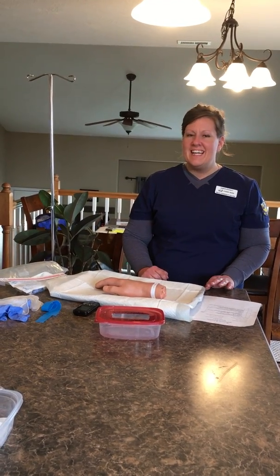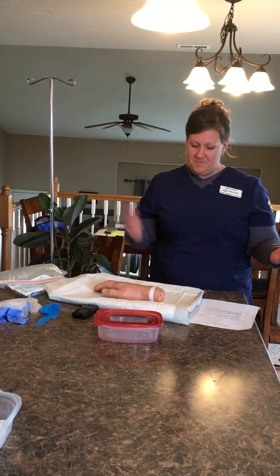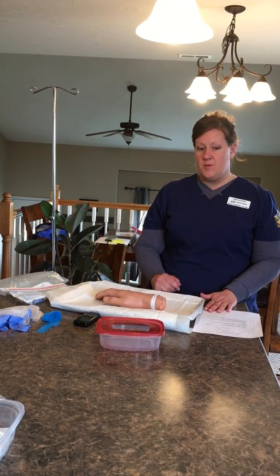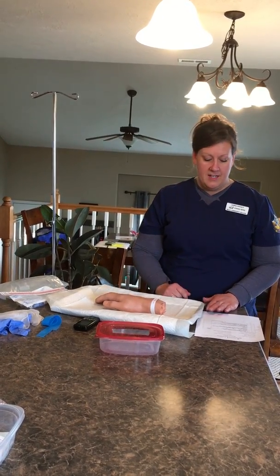I'm Nurse Becky, and I'm here in my Utopia Hospital. Today I'm going to be initiating an IV, a peripheral intravenous infusion.